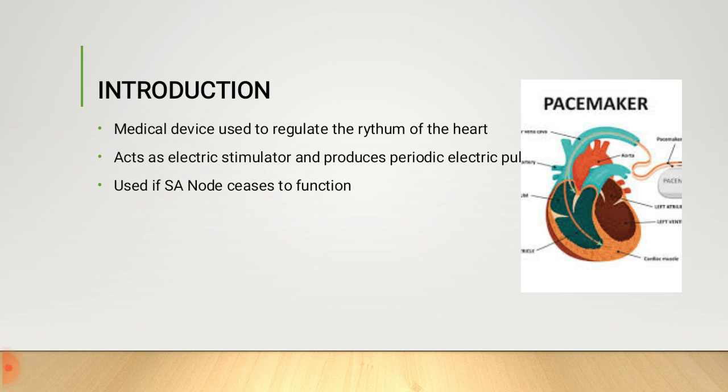The main function of the human heart is to generate the electrical impulses to pump the heart. A pacemaker is a small device that is placed or implanted in the chest or near the human heart to regulate the heartbeat. It generates electrical impulses to pump the heart.